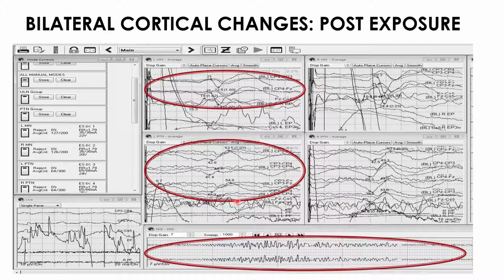For instance, we're seeing a big change in the cortical evoked potentials. Here are the upper SSEPs, here are the lower SSEPs. Both corticals are diminished bilaterally. And in the lower SSEPs, all three corticals are also diminished bilaterally. It's important to do EEG to try to correlate these changes, specifically when you have bad data like this. You want to correlate with anesthetic values, of course, but you can also show through the EEG that obviously shows burst suppression here. It correlates with a non-surgical issue.